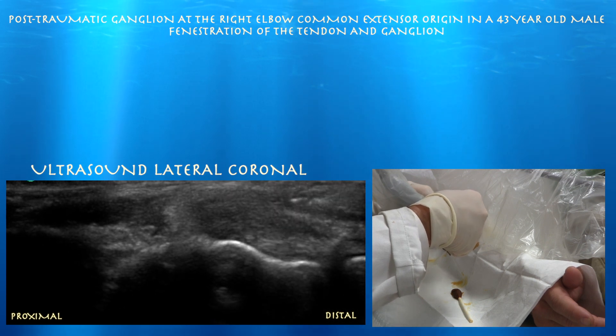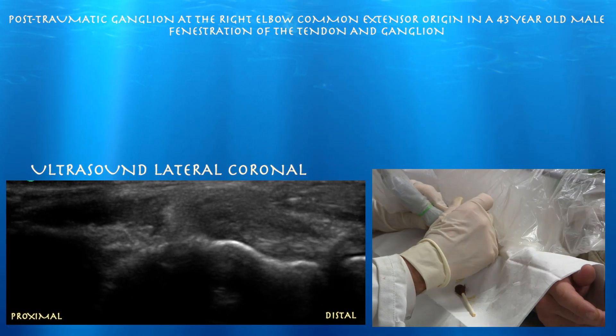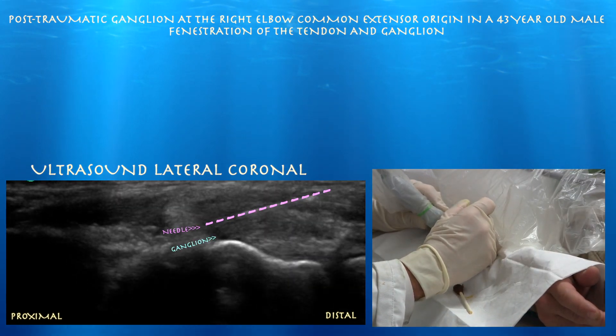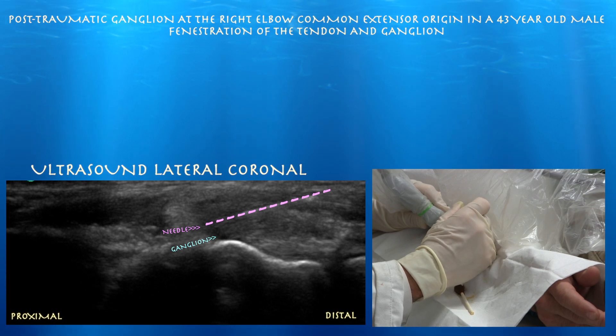We're also doing a dedicated fenestration of the tendon as well, as he probably does have some underlying tendinosis. If you can't drain it, it's good just to break it up — that's what we're trying to do here.